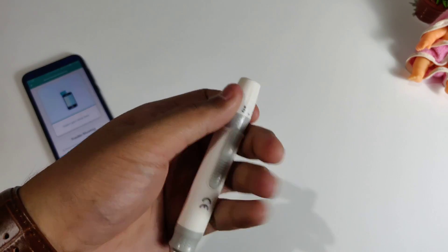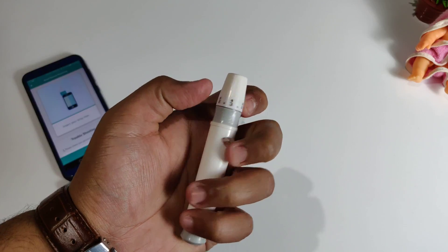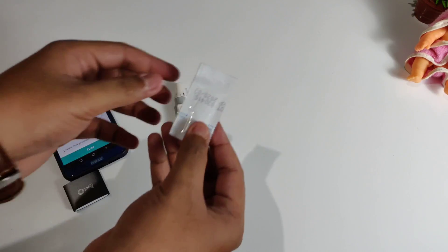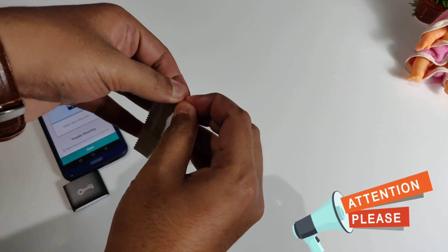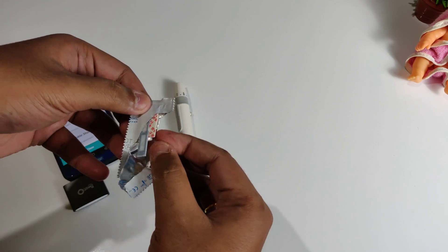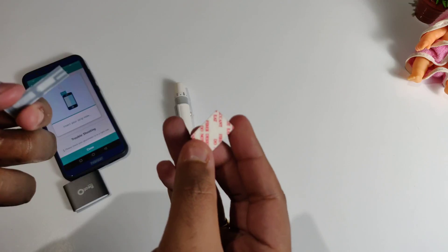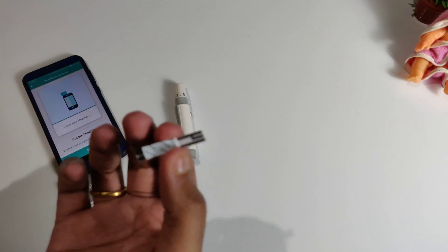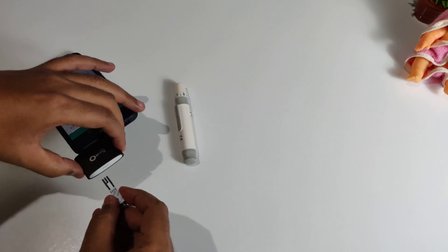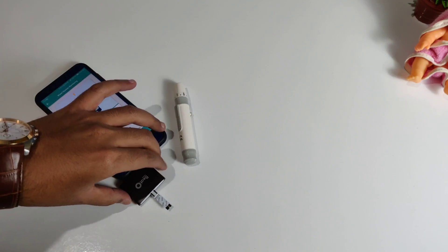One important thing to mention: whenever you are opening the strip, you need to be careful as the part is very sensitive. If you accidentally touch the part where you take the blood from, it will show as already used, wasting a strip at around 20 to 25 rupees - and for 25 strips you need to pay 500 rupees. So be careful when you hold it. There is a white sticker area where you can hold it and then insert it into the glucometer itself. After that, set the injection tool and prick your skin.